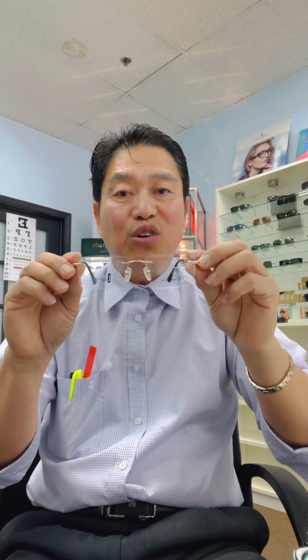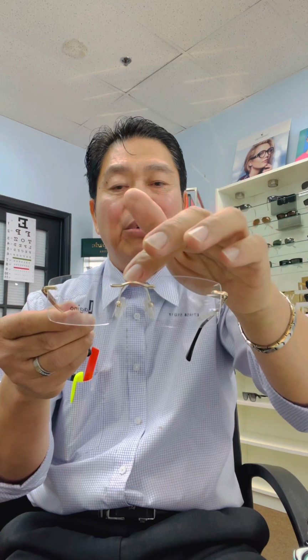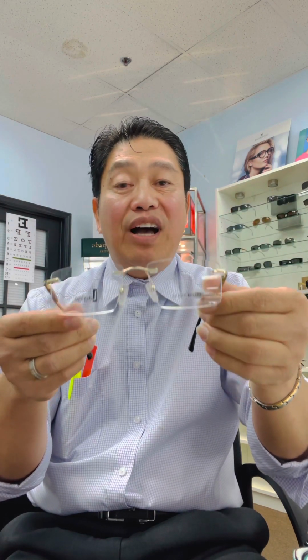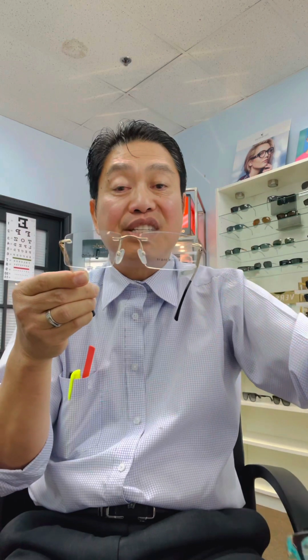Okay, and the next design is, we call it 4-point rimless or full rimless. As you can see, we call it rimless, full rimless, because there's no rim around the lenses. It's just the lens and the frame, the temple and the bridge. Okay, so again, this one is very, very flimsy compared to this design and the full frame design.